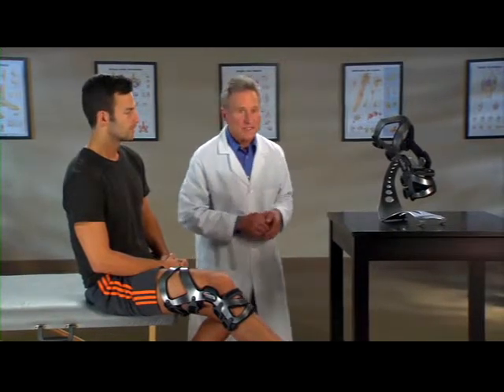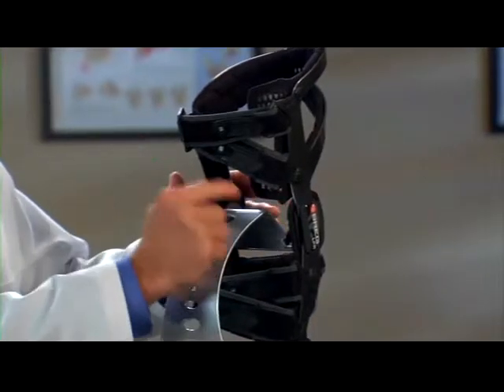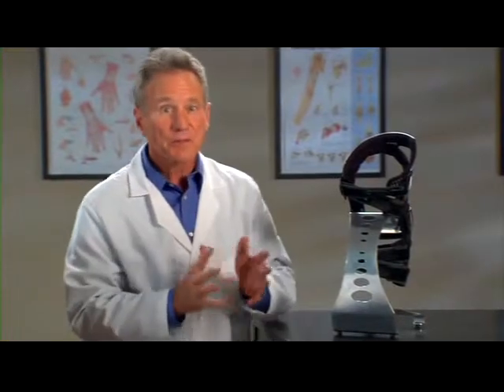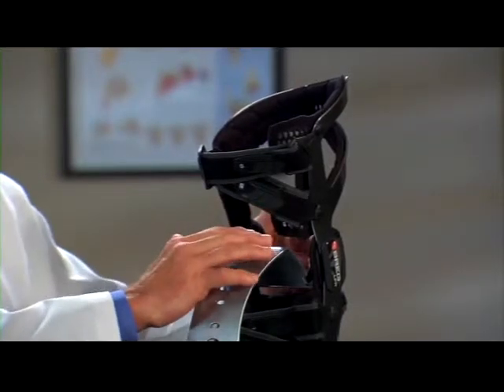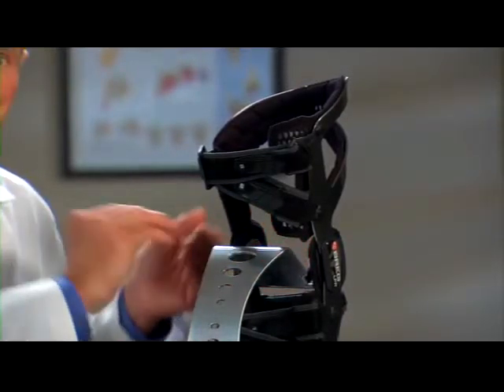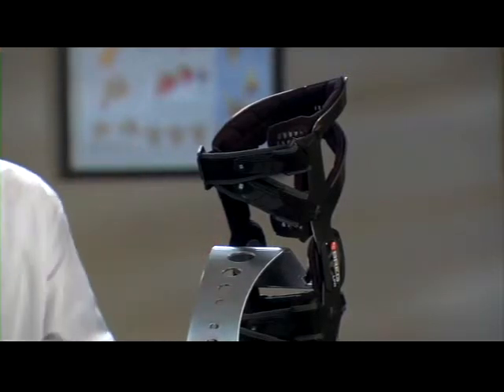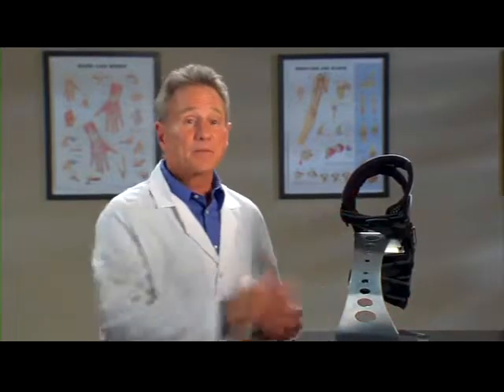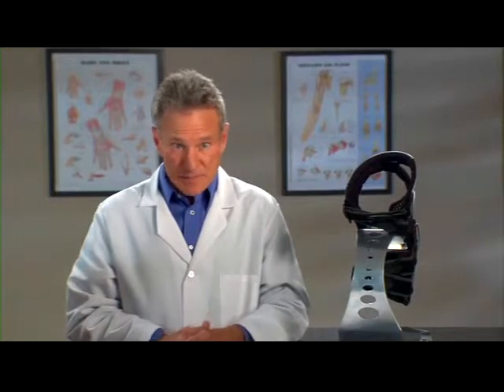Now, look at this. See how the straps are crossed at the back of the knee, opening up this space here? Not only does this simplify strapping making the brace easier to put on, but it was also designed to keep the back of the knee clear. A lot of braces have straps or other elements that press on this area, making it difficult to get a deep bend at the knee. LPR is different — there's nothing on the brace that puts pressure on this area, making it more comfortable without hindering motion, particularly in deep knee flexion.